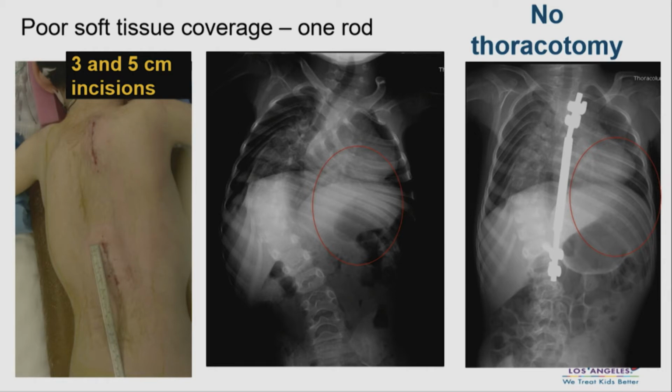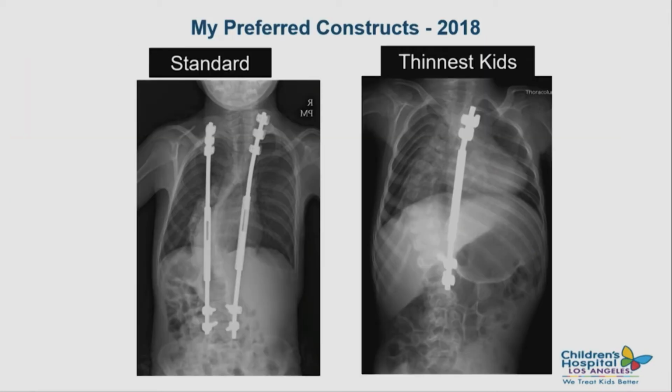And note how close these ribs are together here and how open they are there. Jack Flynn speaks of this as portable traction. I love that idea. And note that there is no thoracotomy. In my mind, unless you have like 5 ribs fused, you don't want to cut through ribs. You want to have nice spaces between all the ribs instead of lots of space between 2.